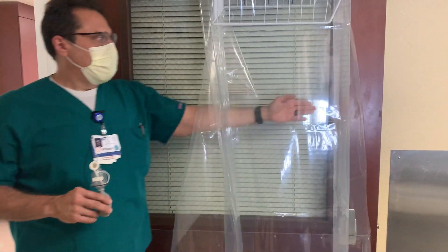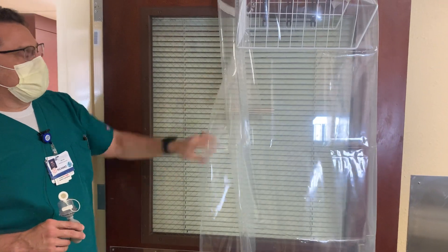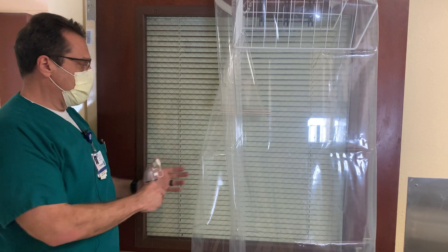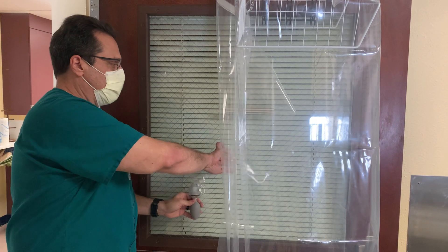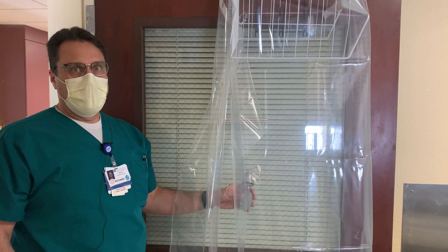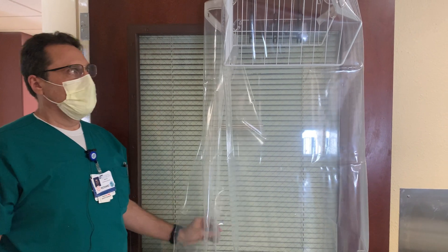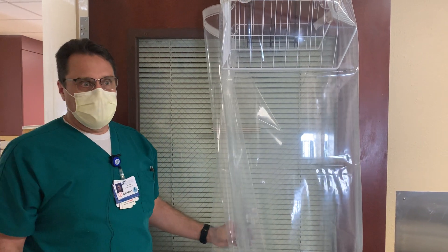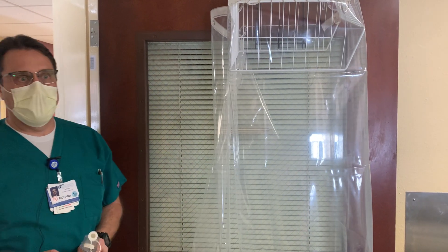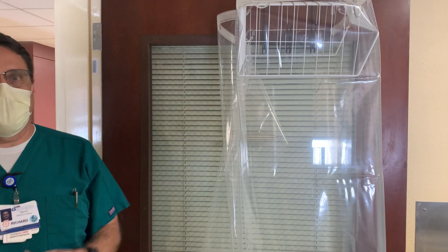They can walk through either side, closing into the shower curtain. When they've got their mask on, you'll reach behind and spritz ten times, like we did with the hood — repeating the alphabet, making them walk in place, turn their head left and right, up and down. Then we'll spray ten more times and have them talk to see if they can taste it. This will take the place of the hood if you don't have the availability of one.